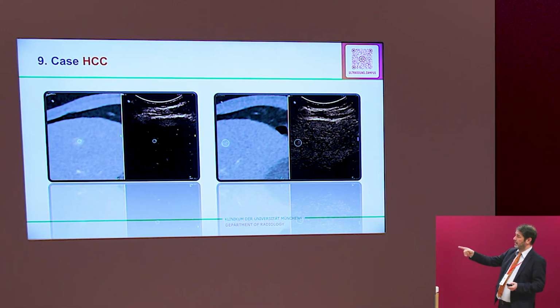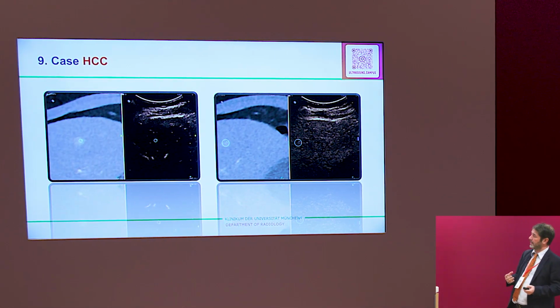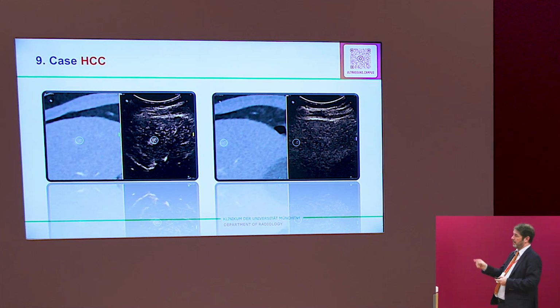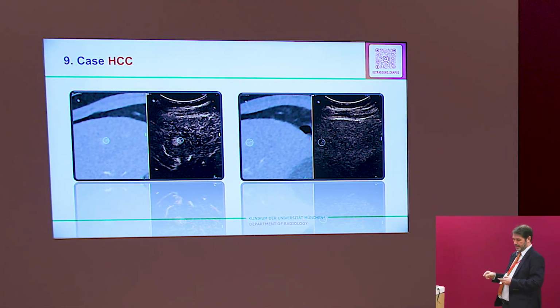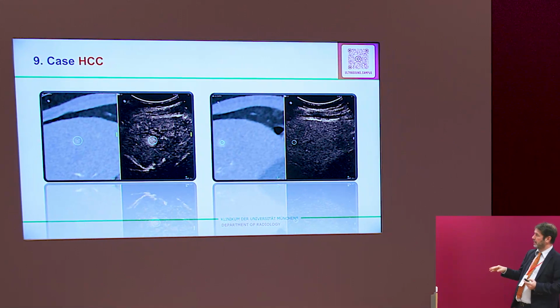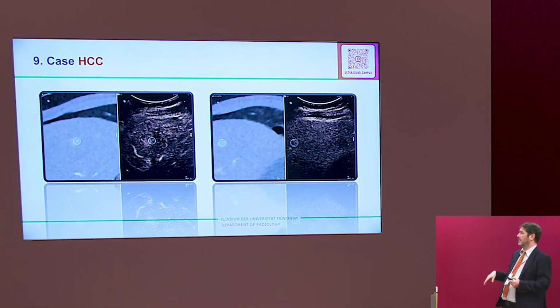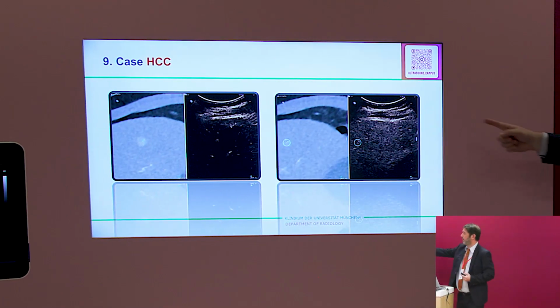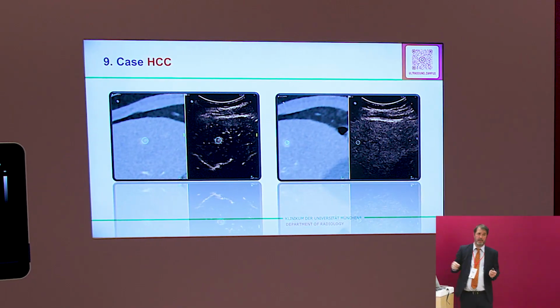So, you see, strong uptake. You see this white ball there inside where the blue circle is. And later, washout of this lesion, late washout, so HCC. This is after 4 minutes, so quite a long time.